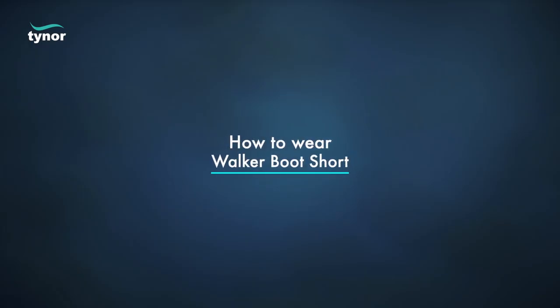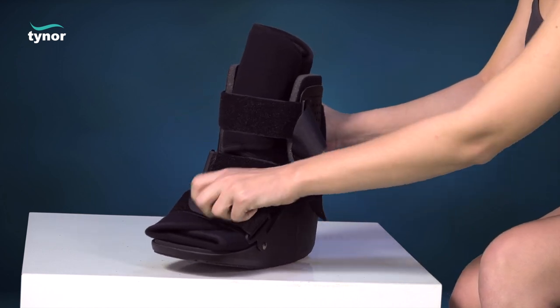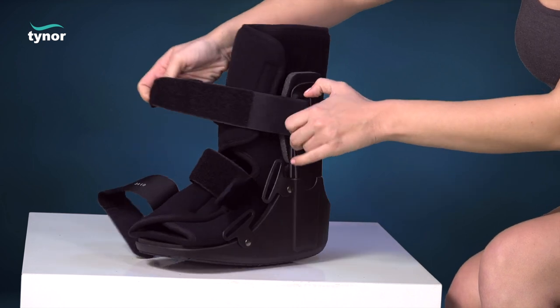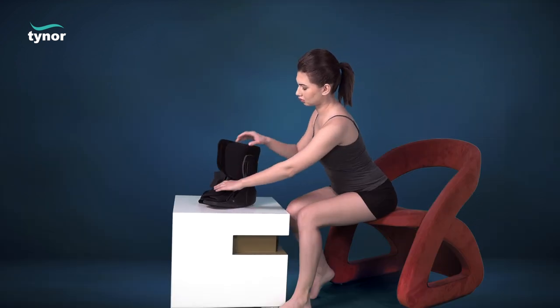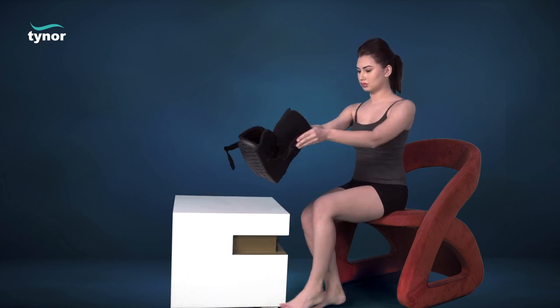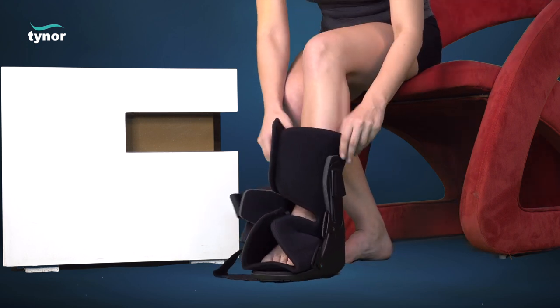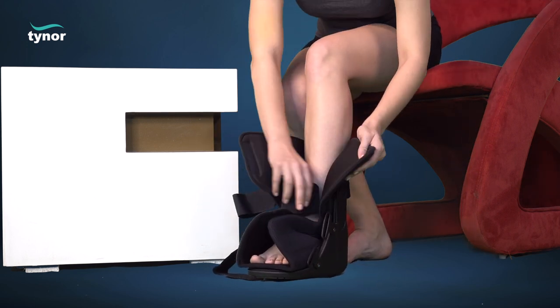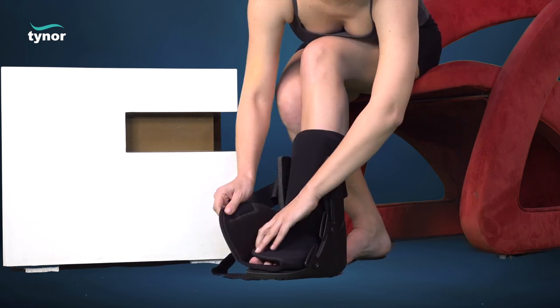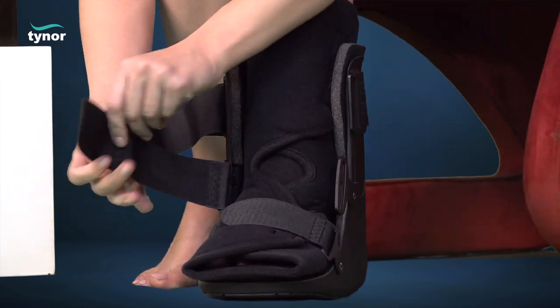Now let us see how to wear the walker boot short. Disengage the hook and loop fasteners to make the product easy to use. Place the heel at the back of the boot, cover with the cushion liner, and apply hook and loop straps starting from bottom to top.